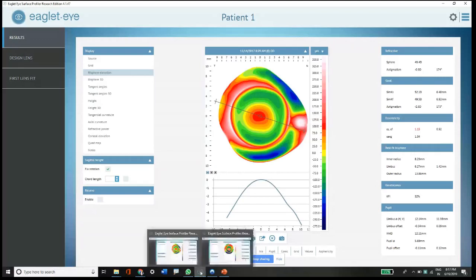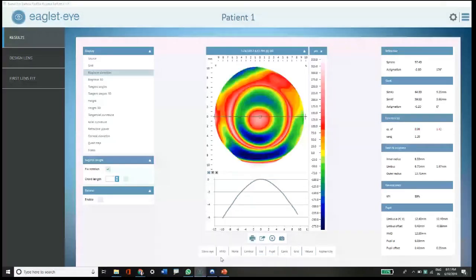I'm going to real quickly also run through a central cone because I have it open here and I want to show you this. There are so many things you can do with this type of image. Just looking at it immediately, you know you're going to be going for a certain type of landing. You know pretty much how high everything is. You've got a great image here.